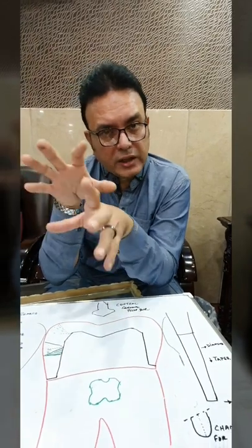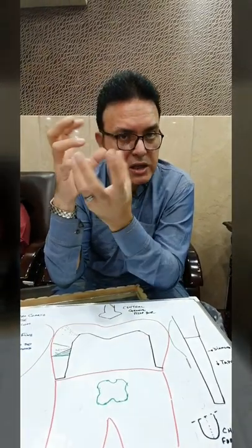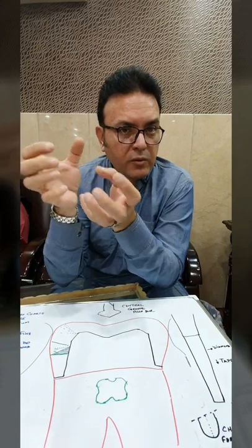So all the salivary proteins, particularly the phospholipids, would get stuck to the tooth surface. Now these phospholipids would be inhibitive when it comes to zirconia crown preparations and cementation. Remember, zirconia has very, very strong affinity for phosphates, and our saliva has phospholipids. So if the zirconia crown is tried out in the mouth and it gets contaminated with saliva, the inside of the zirconia crown would stick all the phosphates and phospholipids, and less adhesion would be achieved.